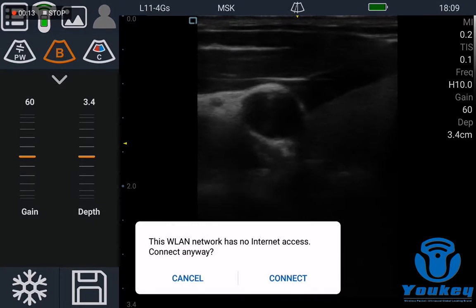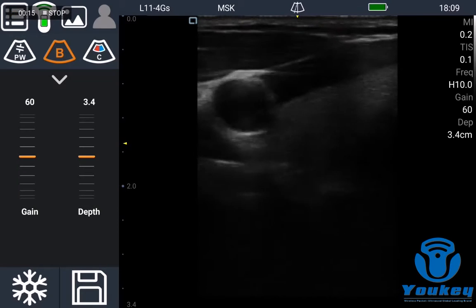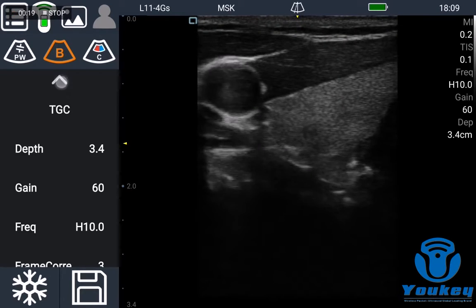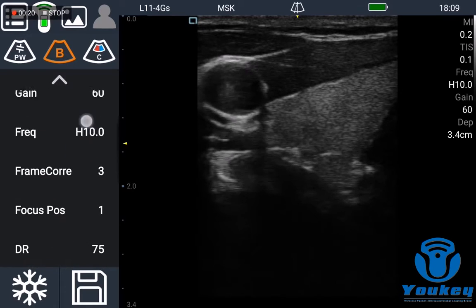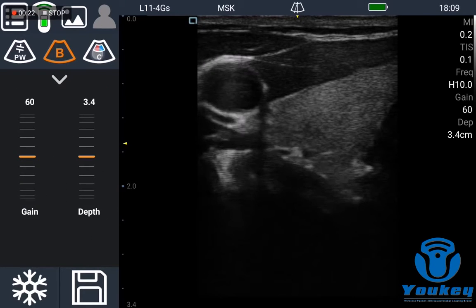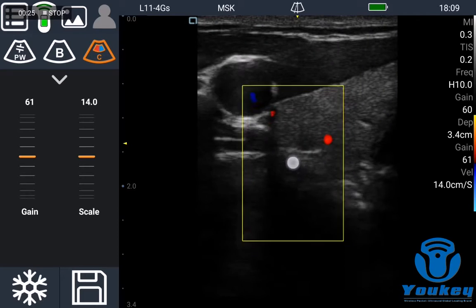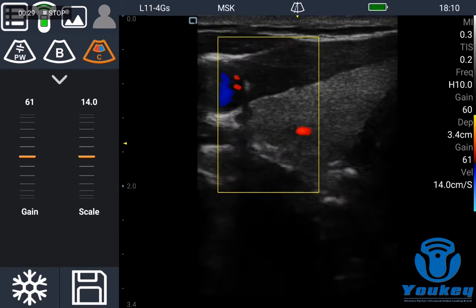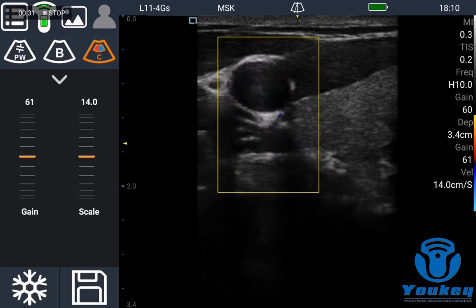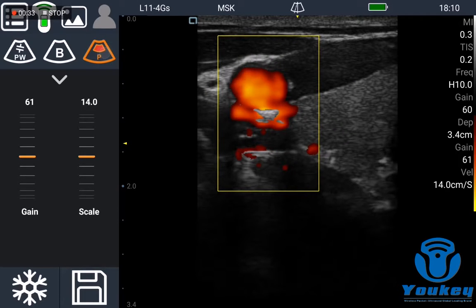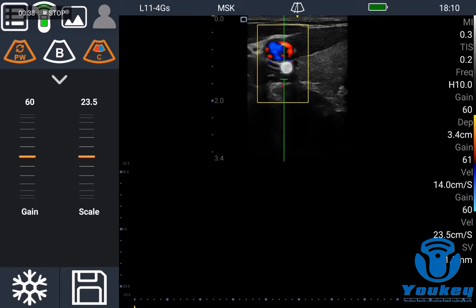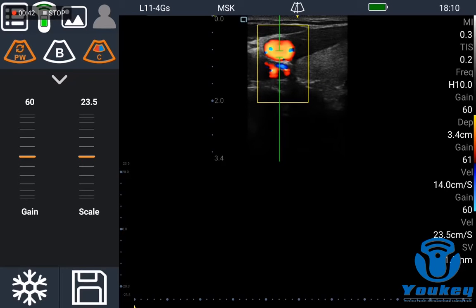Then it's ready for examinations. You can see the images and also change parameters inside. You can enter the color Doppler mode and also the power Doppler mode and pulse wave Doppler mode like this — you click PW again.